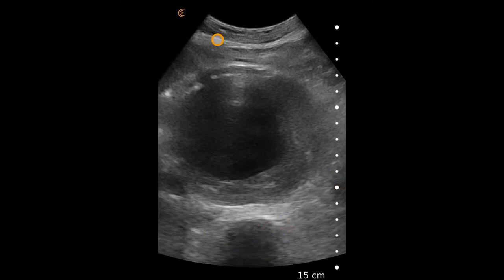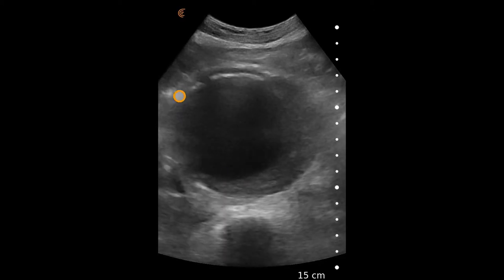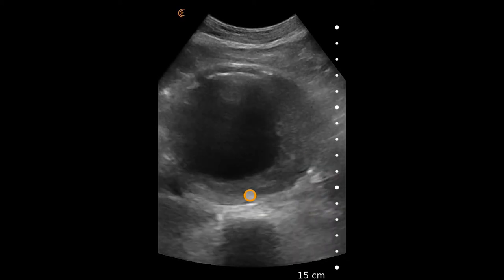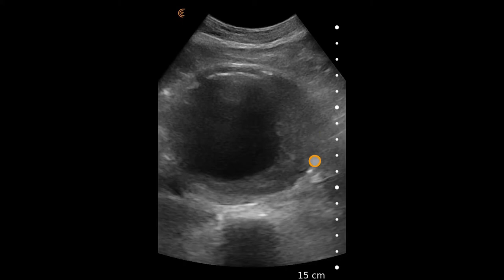Superficial to that, we see a large round structure which, as we scan live, is pulsatile — suggesting vascular etiology. In this case, it is a very concerning abdominal aortic aneurysm measuring approximately eight centimeters, estimated by the dots on the side of the screen.